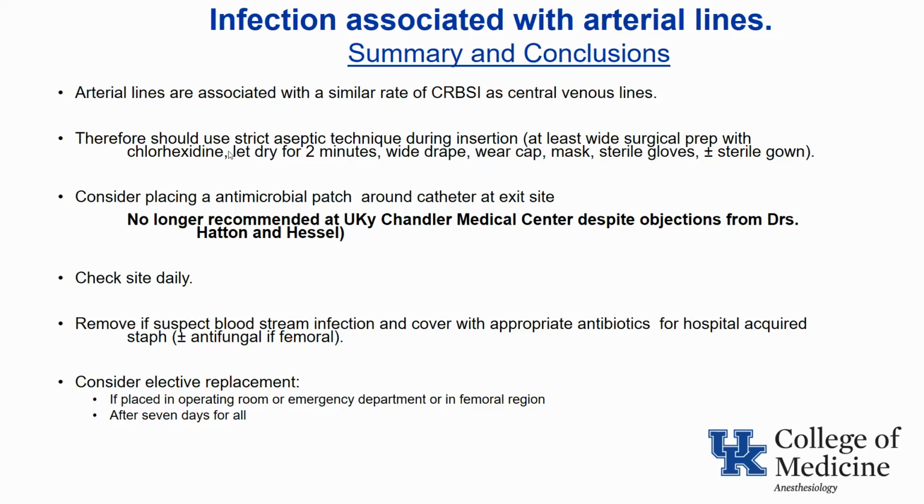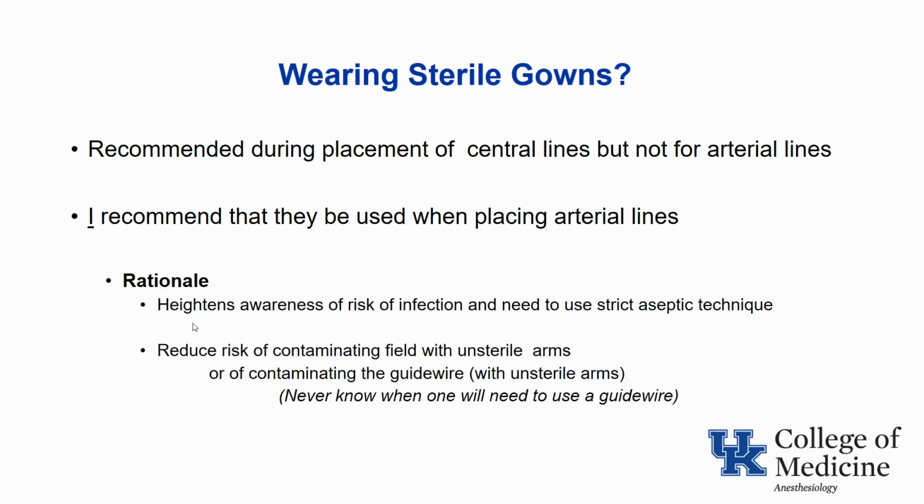Therefore, I believe you should use strict aseptic technique during insertion and place antimicrobial patches around the catheter exit sites. However, this is no longer recommended at our hospital, despite objections from Dr. Hatton and myself. Lines should be checked daily and removed if you suspect infection. Whether you should wear sterile gowns is a matter of debate. I think it's a good idea, but others don't agree.